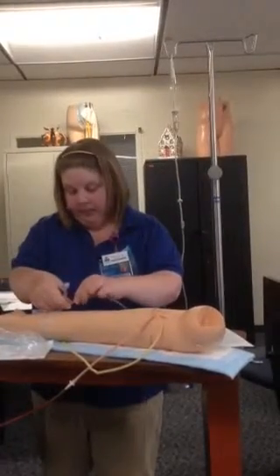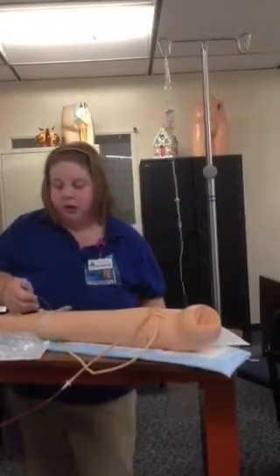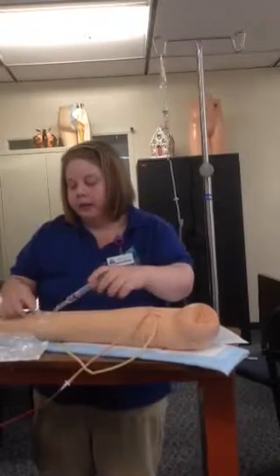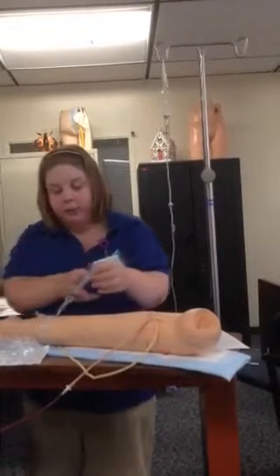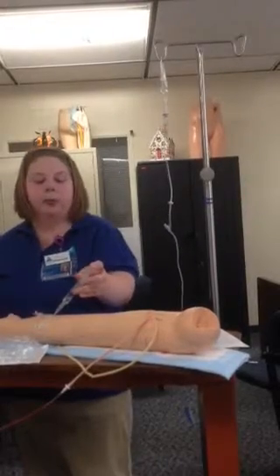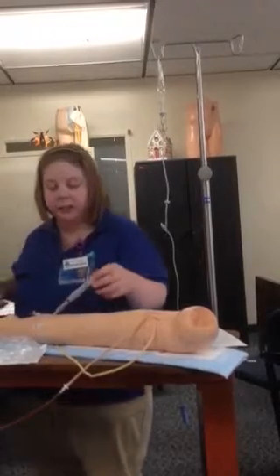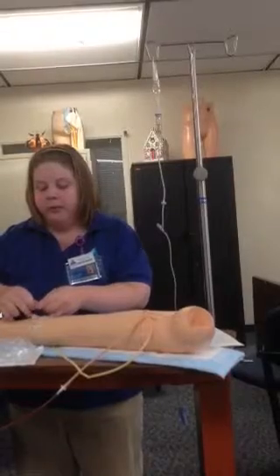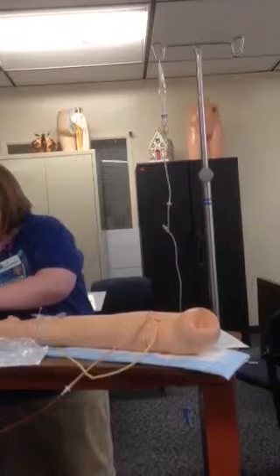I'm going to attach my saline, unclamp their IV line, and I will aspirate for blood return. Means the line is still patent. I'm going to push pause the rest of my saline, my 3 milliliters of saline in there. Now I will clamp off their line. I would have clamped off my line before I attached my syringe.